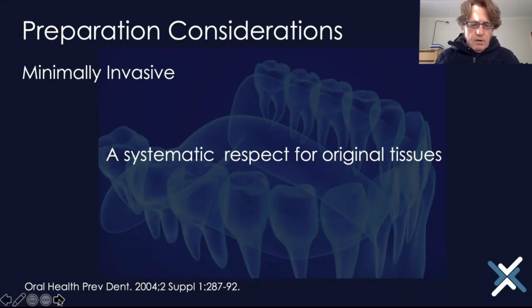And the other thing that I just need to mention here is there are some very, very fine material engineers building our materials. And we need to work with the materials with respect to those guys too. They know what they're talking about. So yes, they want to make it as thin as possible, just as we want. But there are certain requirements in glass ceramics that you cannot change. We cannot change the glass structure. It is what it is, and we need to understand the physical properties of glass structure when we work with them.